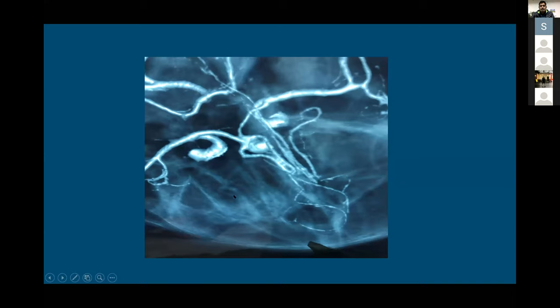This is an aneurysm projected superiorly and a little bit anteriorly. The dominant side is the left side. I always orient the images as if I am going from the right pterional side. This is the carotid, the ipsilateral A1, ipsilateral A2, here is the ACOM, and here are the contralateral A1 and contralateral A2. I will present a video of this case.